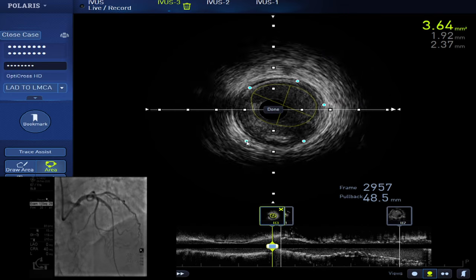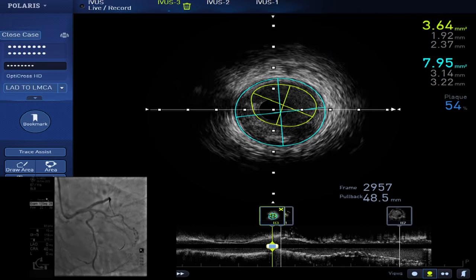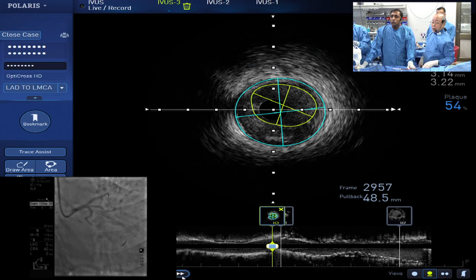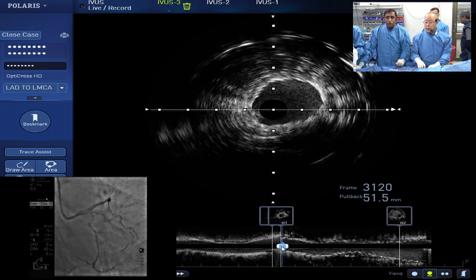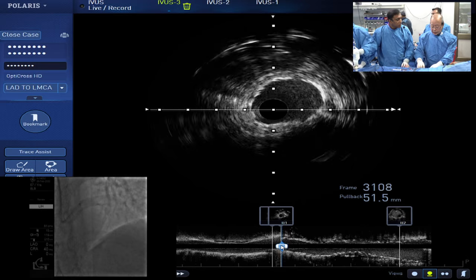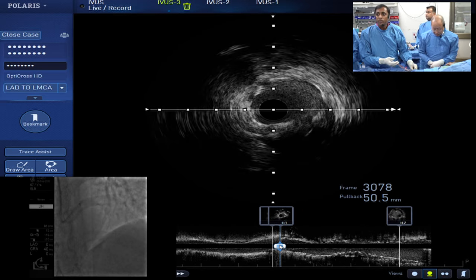Can I review the previous image? Previous one. Okay. This one. What do you think about the branch? Two branches in the ostium. I do not want to touch them. I think they are wonderful. Okay. Good. Only a small pinch, right? A little bit. Okay. In the ramus. So one more injection. The final injection. Okay.